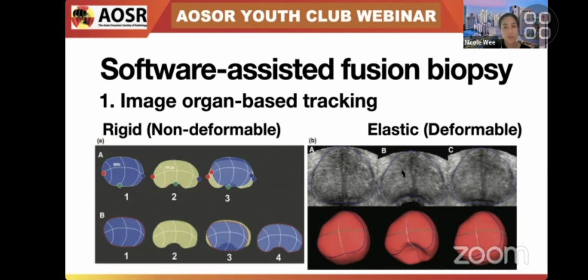And the schematic diagram on the right now demonstrates the efficiency of elastic registration. You can see the original shape of the prostate gland in the top row with the corresponding 3D shape in the second row. In the middle column, induction with a mathematical model shows posterior deformation of the prostate gland with a spherical indentation, which simulates the insertion of an ultrasound probe. And in the right-most column, after activation of the elastic registration software, the original 3D shape of the prostate gland has been rebuilt. So suspicious lesions are then loaded onto the system, which projects the target into the biopsy aiming mechanism on the ultrasound probe.